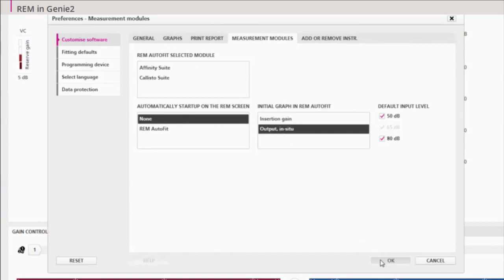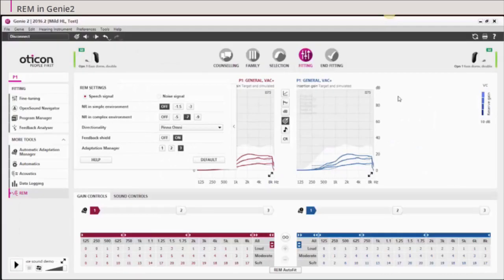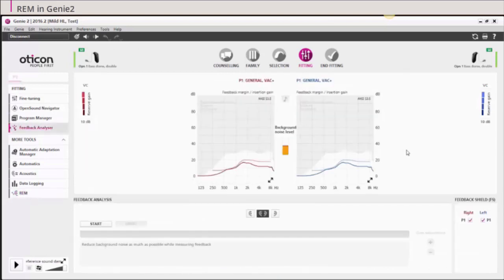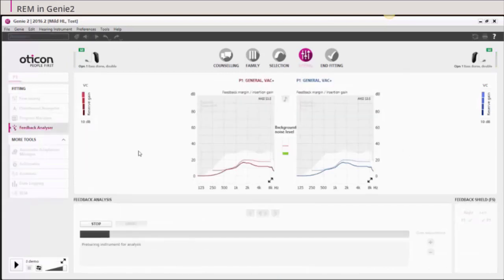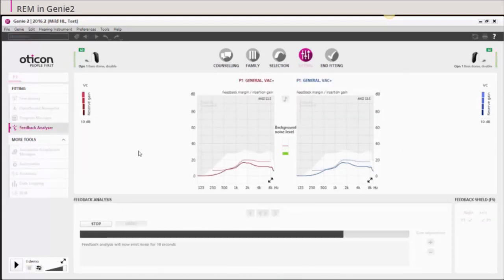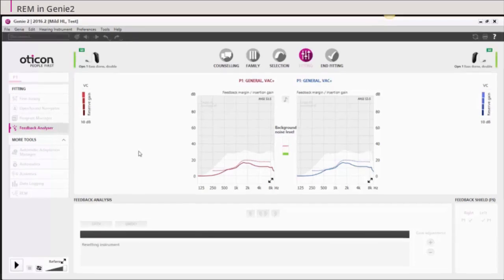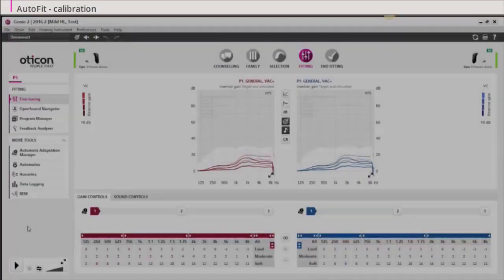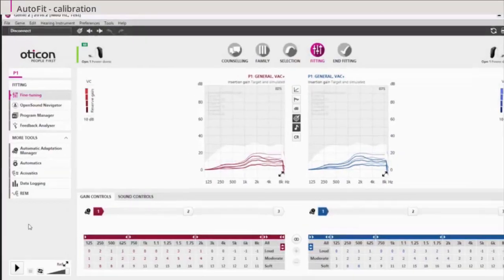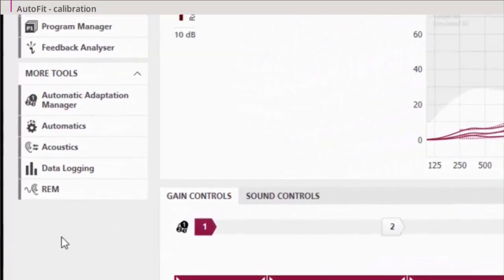Before beginning the REM, make sure that the selected acoustics are correct for your specific client. You must also run the Feedback Analyzer. Now proceed to the Fitting Step.